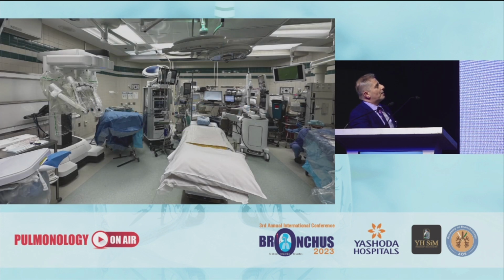This case was prepared in the morning with the Ion and the Xi in the same room. The sterility and the equipment for the Xi stay on this side. The equipment for the labeling using the Ion is on the side and can leave the room after we get the labeling done.